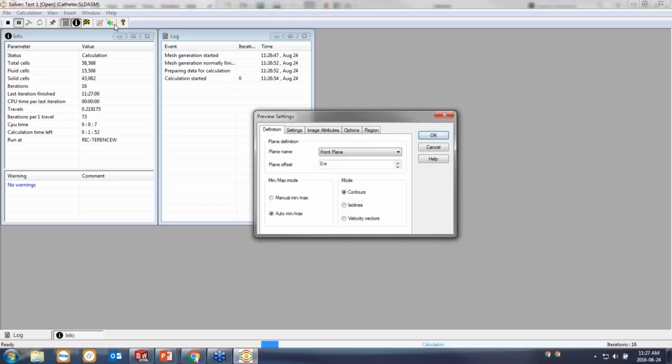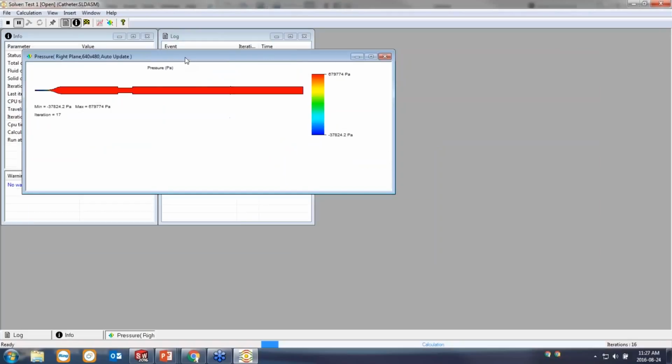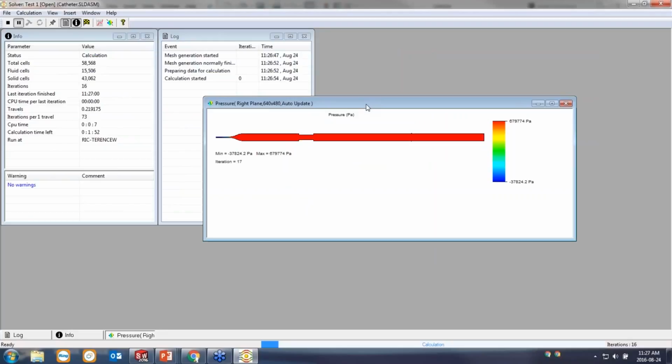The first is insert a preview plot, and a preview plot is a great way to understand what's happening. You can take a look at the results before the solver is even finished. So I'm going to slice along the right plane of this model, and I'm going to monitor, let's say, the pressure. I'll click OK, and I get a preview plot of the pressure at this particular iteration. And then as I continue to run the analysis, you can see that this plot is going to update in real time.